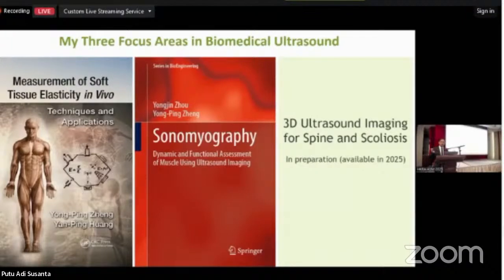The ultrasound, as all of us know, can show different muscle parts in our body, no matter whether they are neighboring or overlapped. So this actually made us think in 2006. And we created this name, and now it is more and more used. So the idea is that we use the muscle architectural change as an indicator for the muscle function. And that can be used for muscle control as well, like a prosthesis. And we are working on other control as well as muscle assessment.